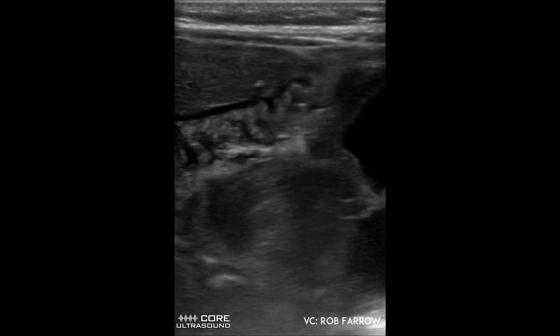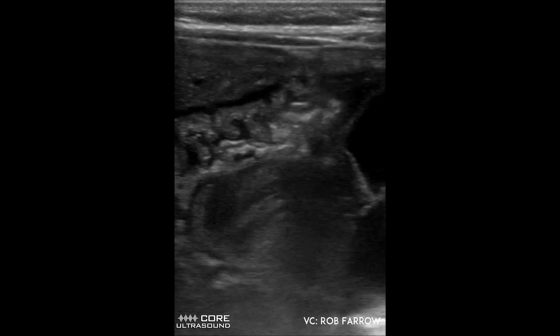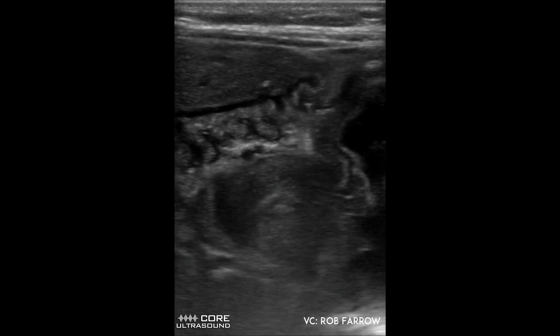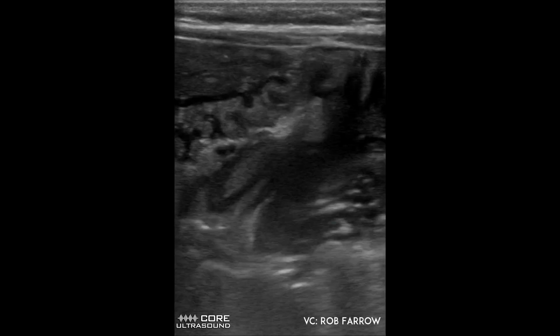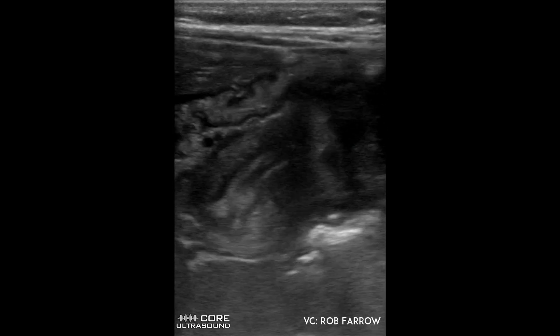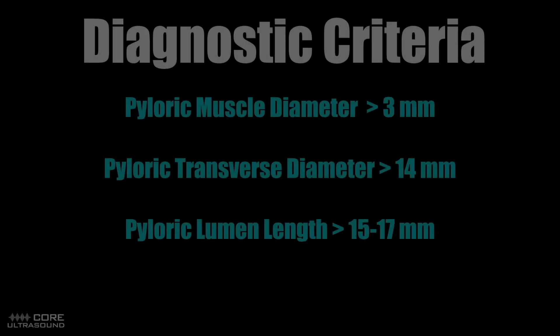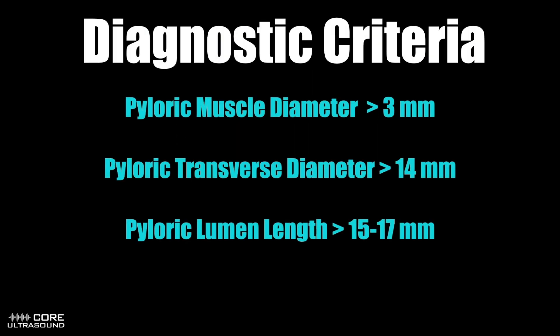On the right side of the screen, we see the antrum of the stomach leading into the pylorus. There is some retrograde flow, but no forward flow. Now that we have our scan, we need to think about diagnostic criteria and make our measurements, as seen here.